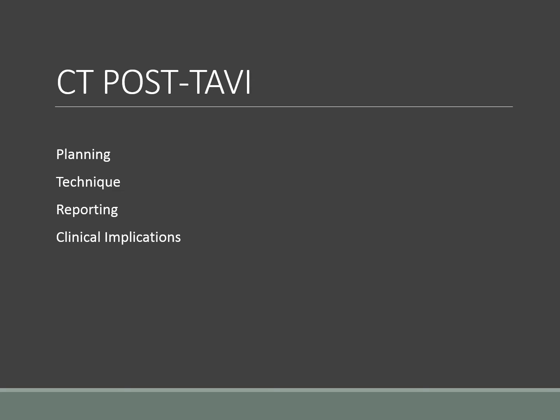My topic today will be divided into four main domains. I'm going to talk about the planning of the CT itself on the scout, as well as the technique, whether prospective or retrospective. I'm going to talk about the important points to include in our report, as well as, at the end, a very important point which has a very important clinical implication on those patients.